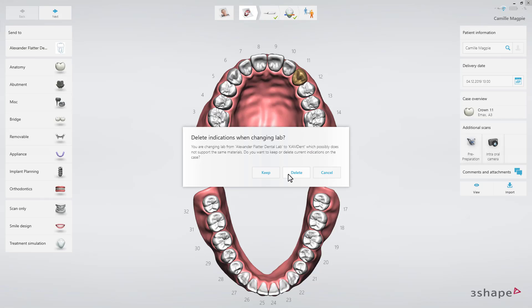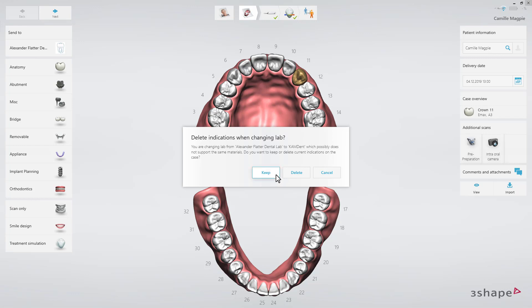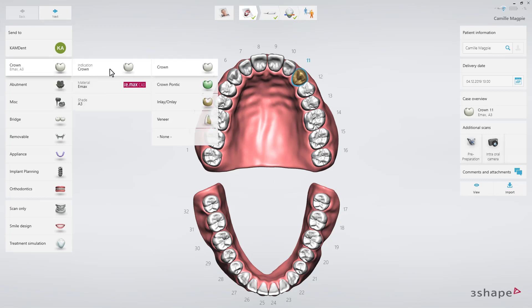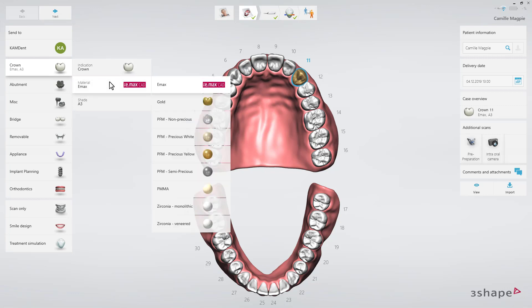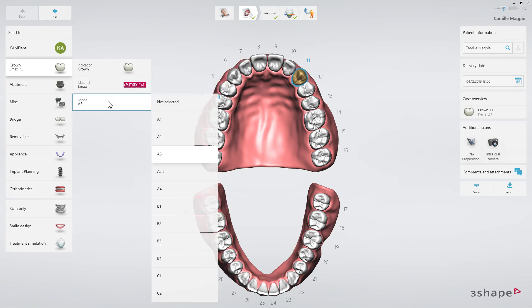Once the lab has been chosen, the order form will be updated according to the range of services offered by the new lab. Trios will try to preserve as much information as possible, but it may be necessary to re-enter the information regarding the restoration, such as type of restoration, material, etc.